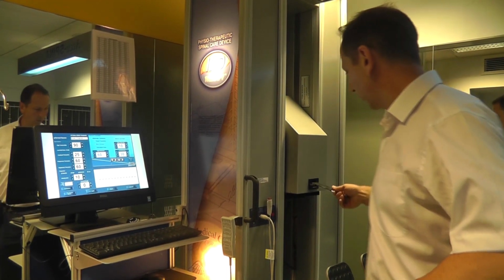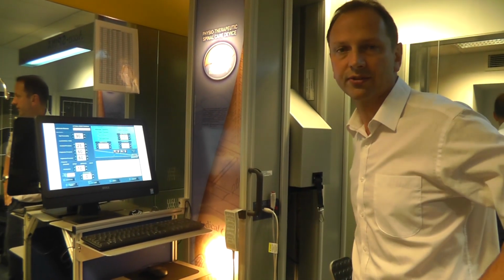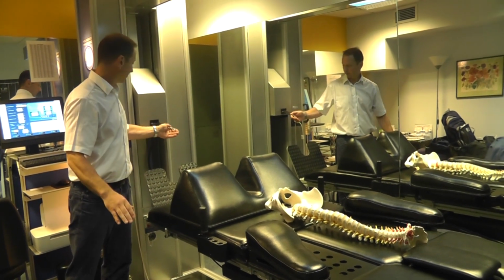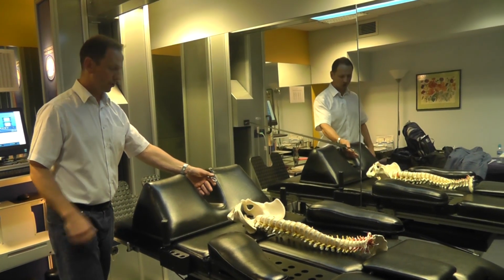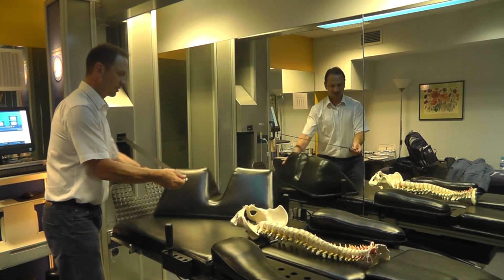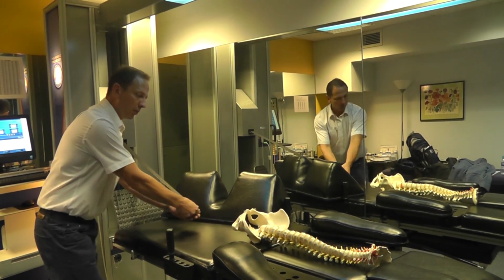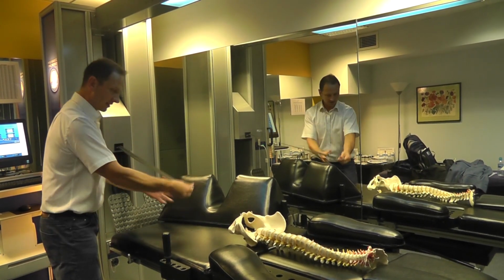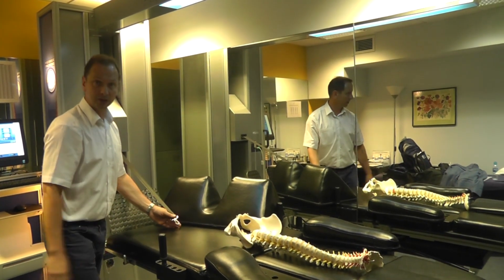Okay, from here, I'm going to pull this belt out and connect it to a harness. So with the patient lying down, knees bent, we're going to pull the belt out and connect that to a harness. Now, depending on the angle, this is physics and vector forces. Depending on this angle, we have what's called a point of application of the force. So the steeper the angle, the further up the spinal column the force is going to be directed.